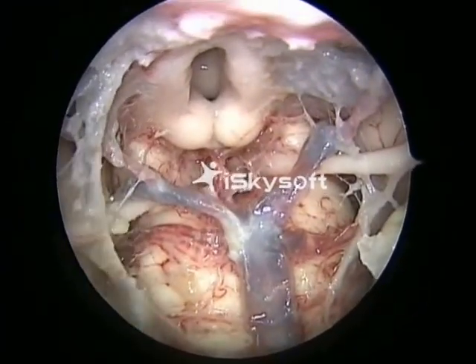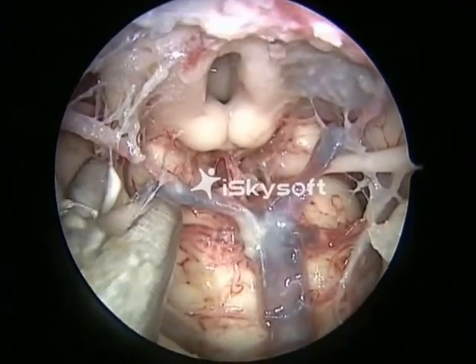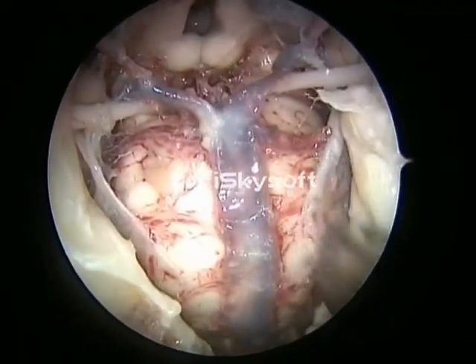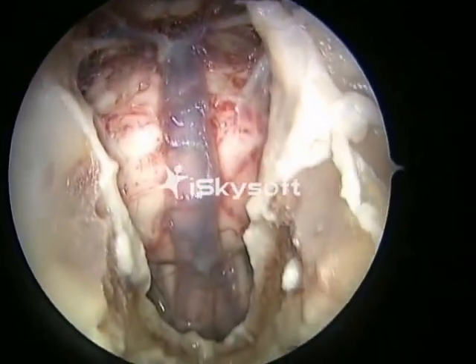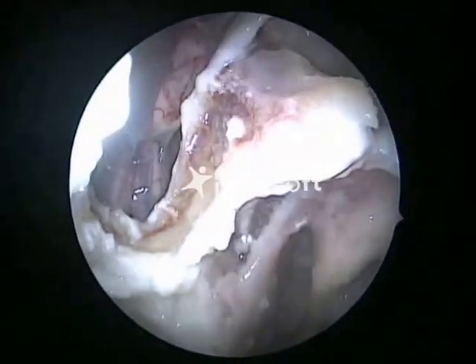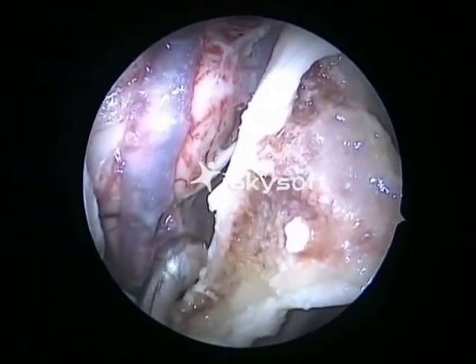The arachnoid layer is being teased out very gently. You can see the basilar artery. That's the VBJ. We are going to use an angled telescope to view inferiorly and laterally to demonstrate the various cranial nerves.